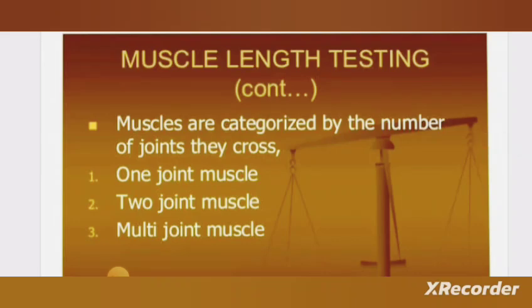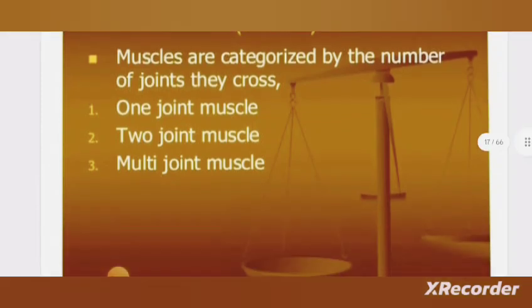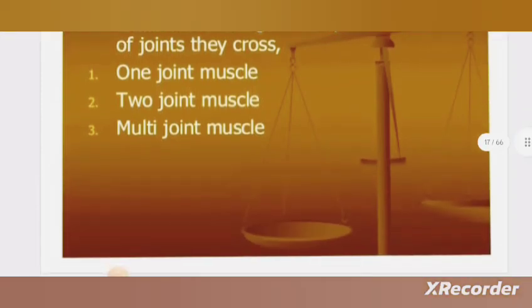Muscle length tests are categorized by the number of joints which the muscle crosses. It may be a one-joint muscle, a two-joint muscle, or a multi-joint muscle.